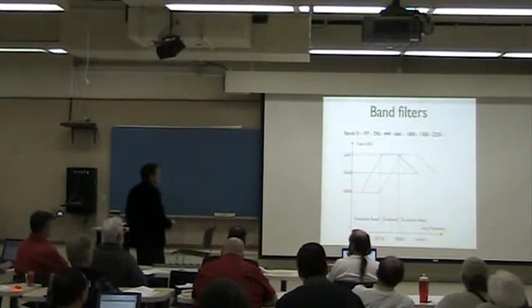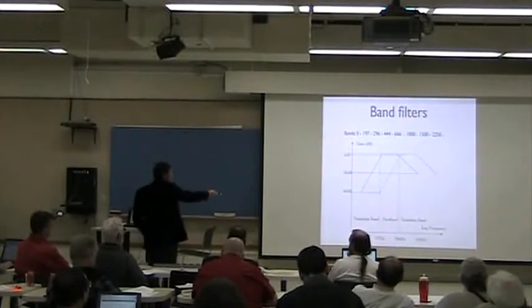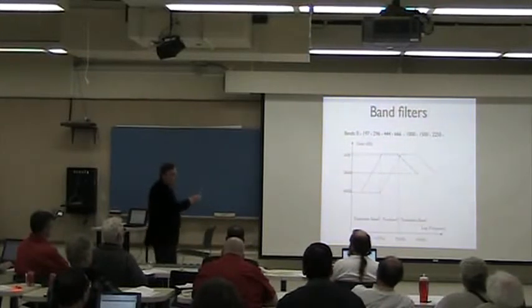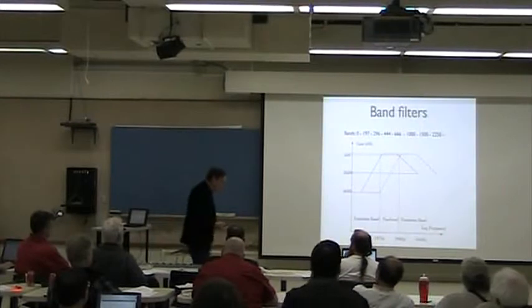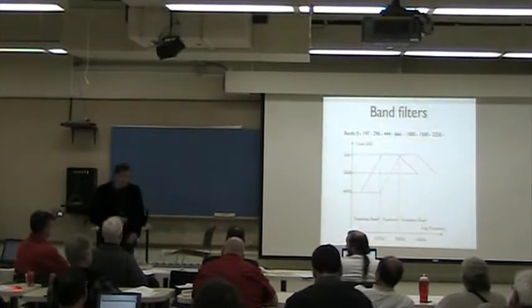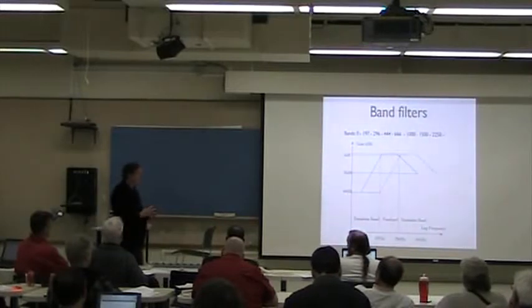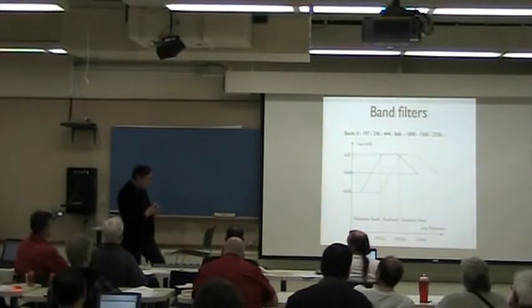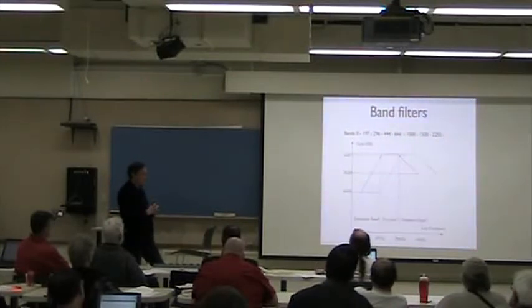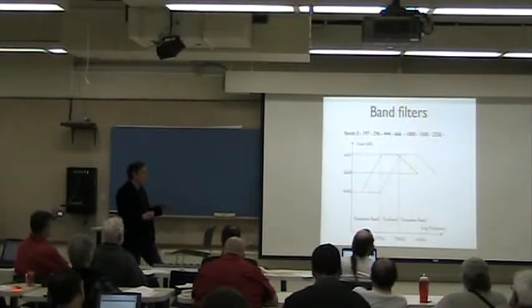So this 60 dB at this point, and 30 dB at this point, is a very important part of the algorithm, because according to the hearing loss model, this is how you introduce the frequency masking, and frequency masking is a very important part of how to recreate understandable speech.